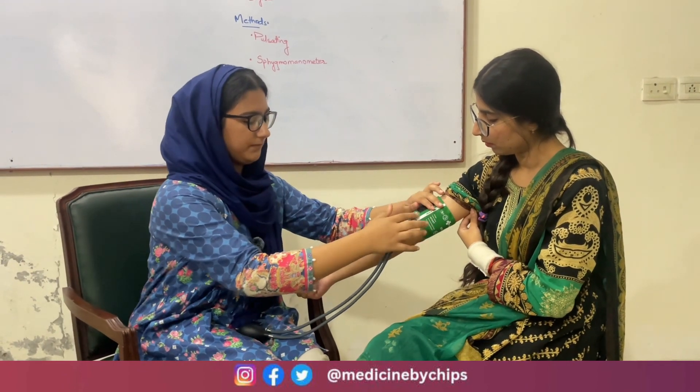We will place the cuff on the arm so that the pipes are directed downwards and medially. First, we will perform the palpatory method. I will feel the pulse from the radial artery, which is below the thumb.